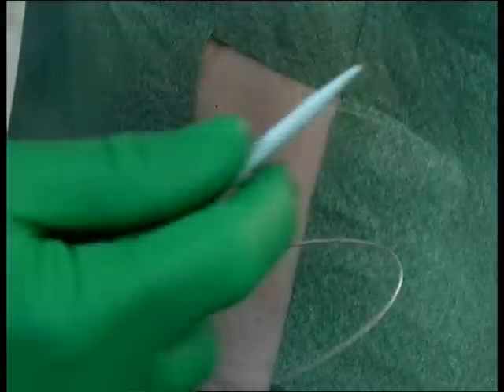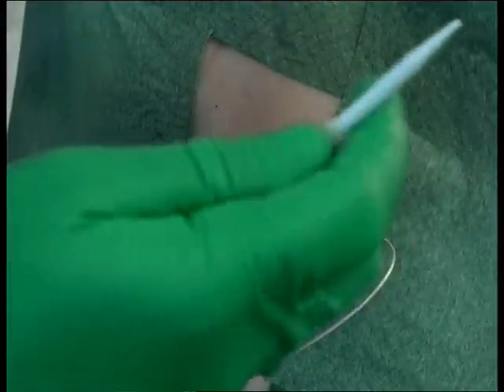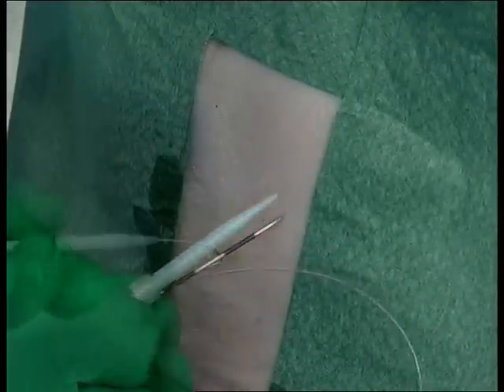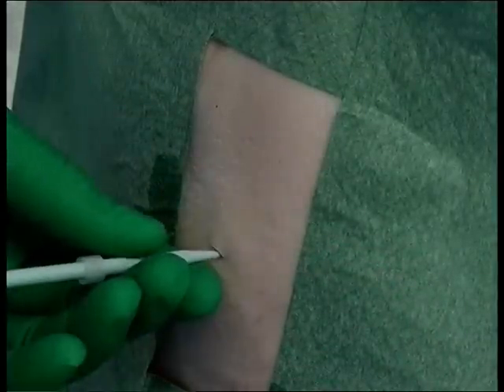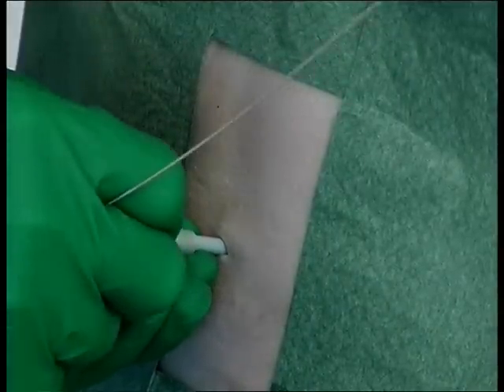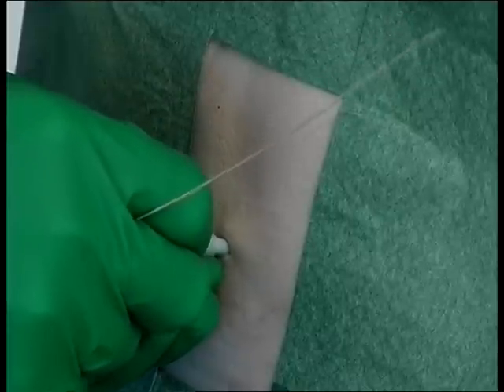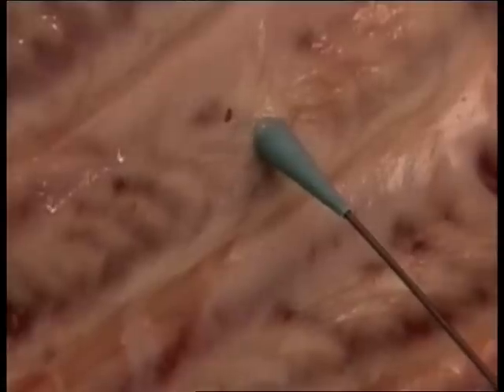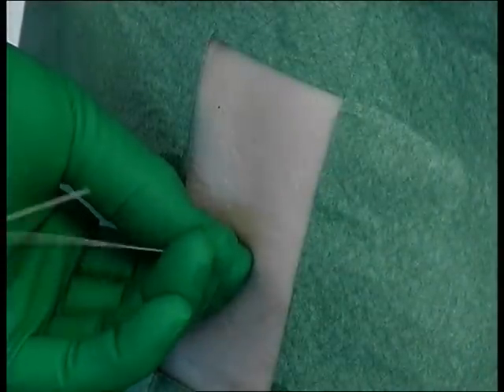If not previously done so, set the sliding stop to the correct position before insertion. Pass the guide wire into the tip of the 10 cm dilator and insert with a rotational movement. Do not insert beyond the safety stop. Carefully remove the dilator, leaving the guide wire in place.